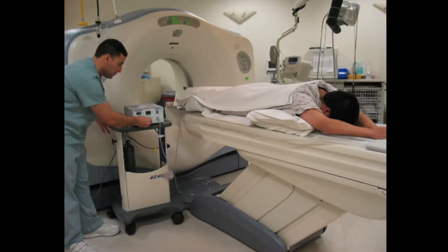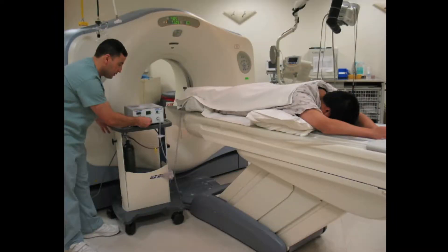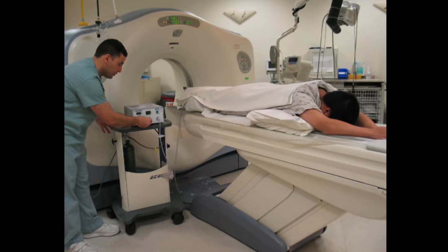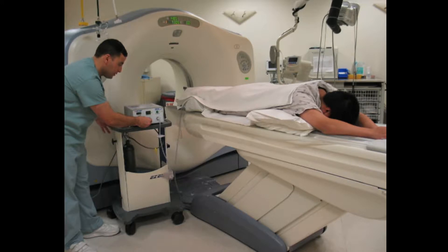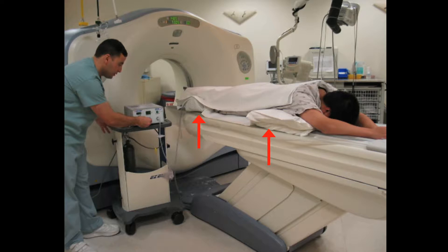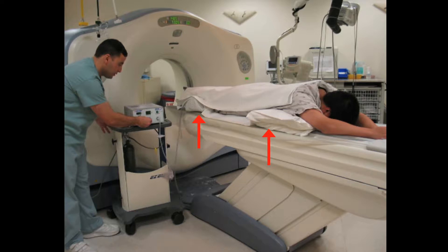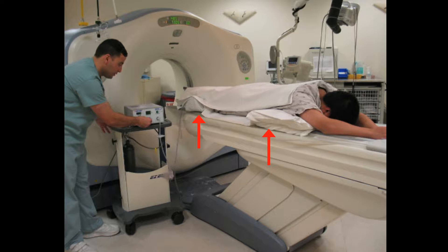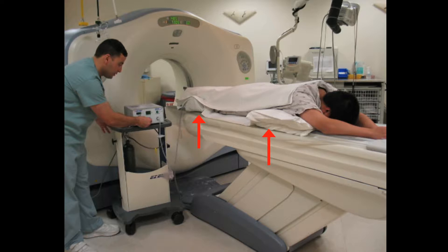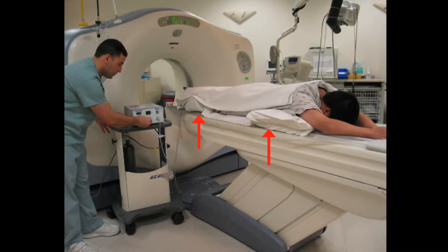This is an example of a patient — actually my research assistant — in the prone position. We tend to prop the chest and the thighs up with pillows and a wedge to lift the trunk off of the CT scanner table, and this allows easier distension of the transverse colon.